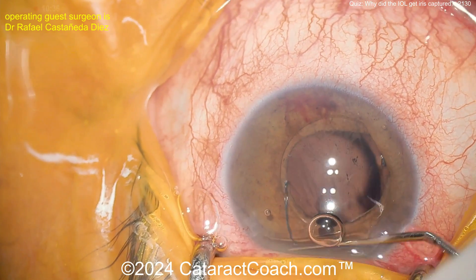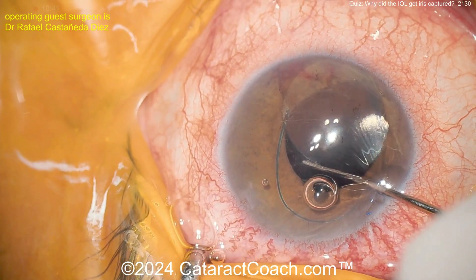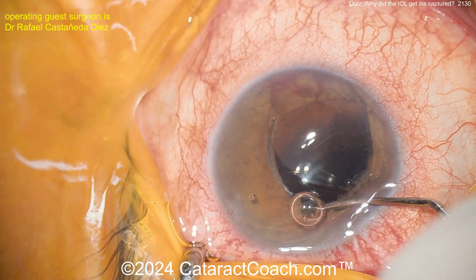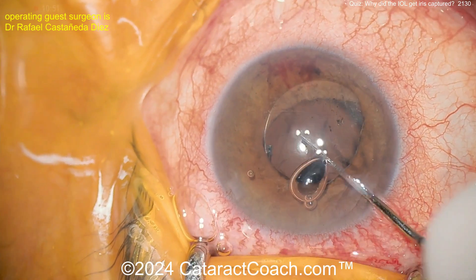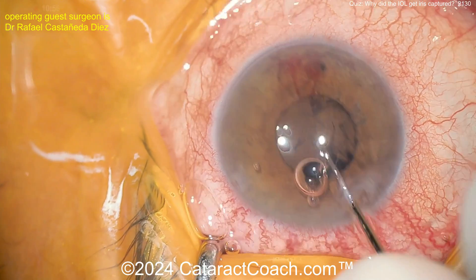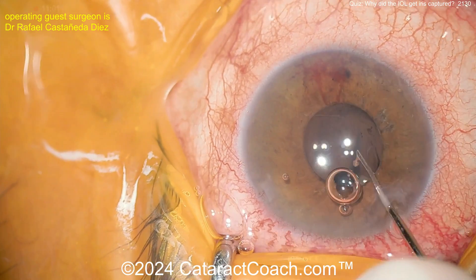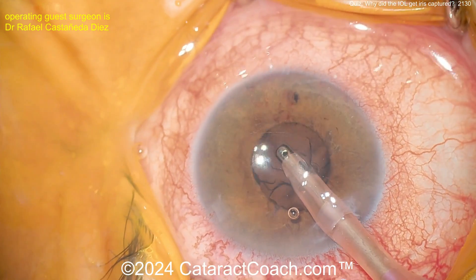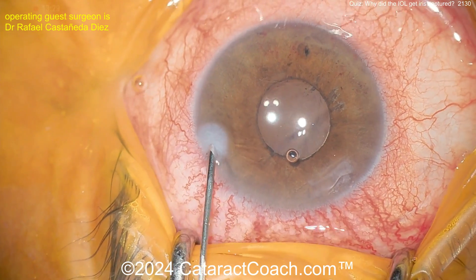Using that same hook to deliver the trailing haptic — if you push at the haptic-optic junction, you can actually dial the lens while slightly pushing down, and that allows you to get it in a little more easily. Use the second instrument to lift up the iris and double-check everything, ensuring great sulcus support for that lens. If there's still some rhexis available, you can do an optic capture, which also prevents the IOL optic from coming forward and getting captured by the iris again.